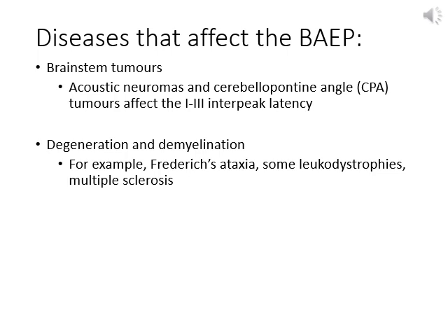Any degenerative or demyelinating condition that affects the brainstem will also affect the BAEP. For example, Friedreich's ataxia, leukodystrophies, and multiple sclerosis all affect the integrity of the signal passing through the brainstem. If the signals are still conducted through the brainstem, but the conduction is less intact, for example, early in the disease process, then this will be observed as an increase in the interpeak latency between waves 1 and 3, or 3 and 5, or throughout the brainstem between waves 1 to 5.